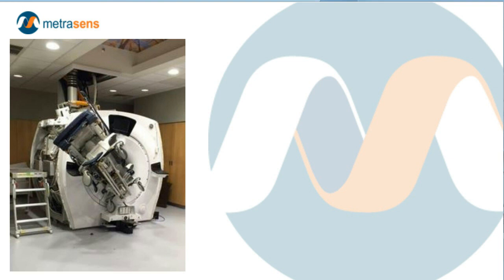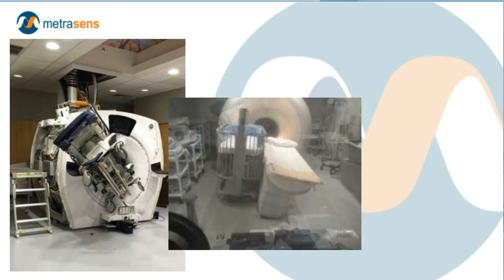So this is one of them, and this is another. This image, it's kind of grainy, it's hard to see, but what you're seeing here is a crib, an infant being brought from a pediatric or nursery unit for MR imaging. And if your infant is sick to the point where they're in the hospital, they need advanced medical imaging, probably the last thing you want to do is involve them in a car crash kind of scenario, like bringing a ferromagnetic transport into the scanner room.